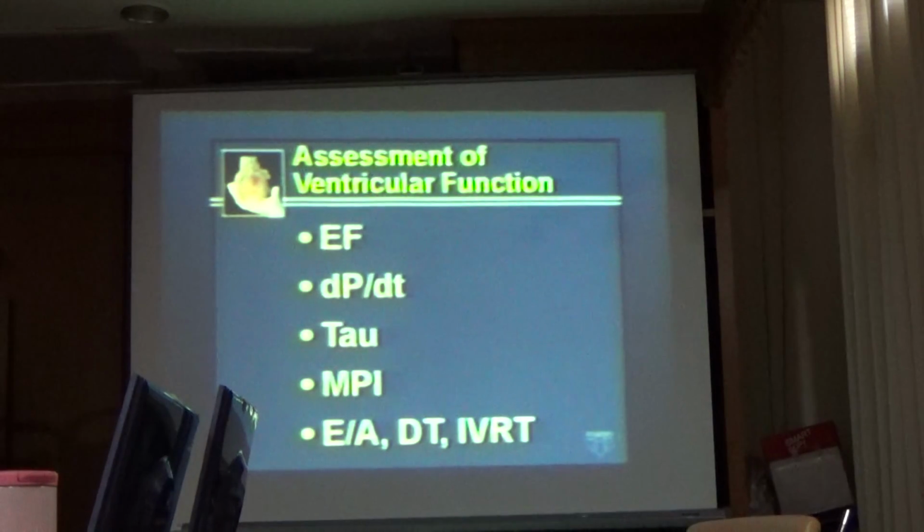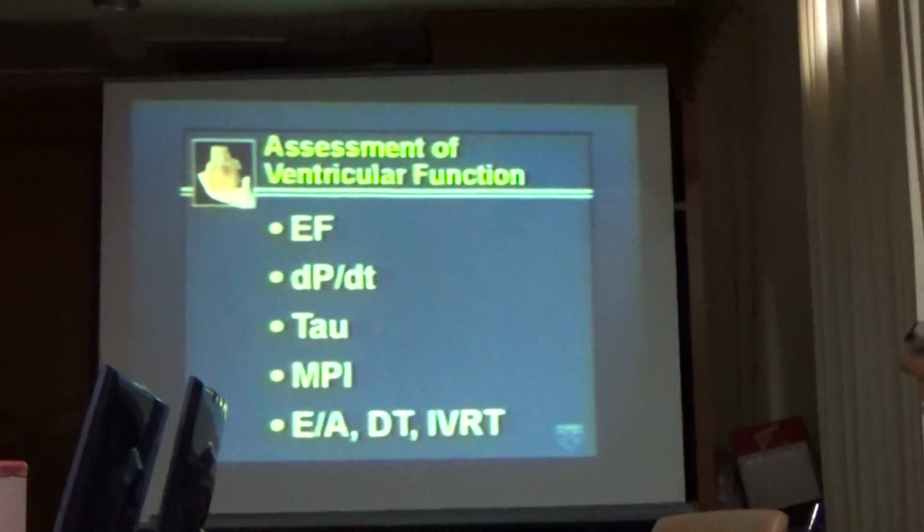We are also utilizing Doppler for assessment of ventricular function, both systolic as well as diastolic. And as Dr. Seward mentioned, in our third segment, we'll be concentrating upon the utility of Doppler for diastolic function assessment using E and A velocity, E over A ratio, and isovolumic relaxation time, as well as the time constant.